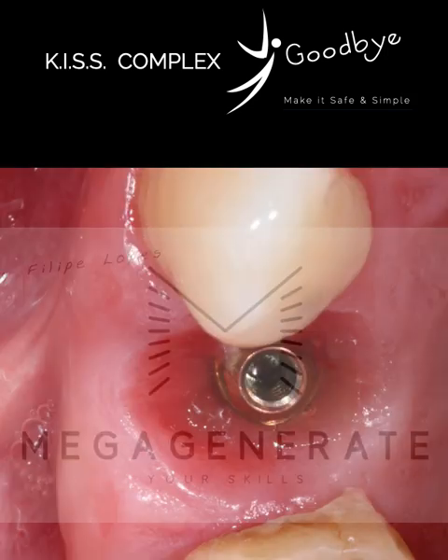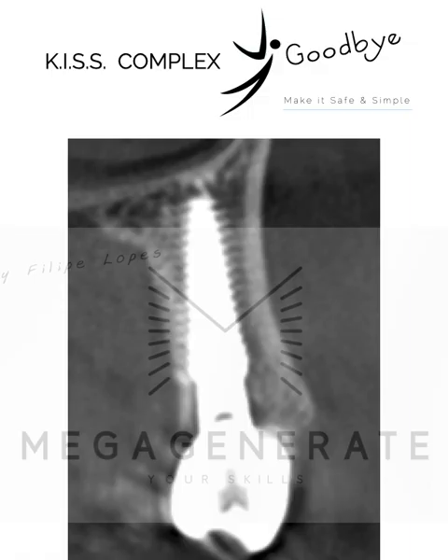But the thing is that you can end up with this beautiful gingival contour. And remember, this is not the implant you're looking at. You're looking at the surgical abutment. In this case, this is an octa abutment, and the implant is well underneath this. We're talking about more than 4 or 5 millimeters underneath. That's where the implant's connection is. Okay, so that's the way you can do it.